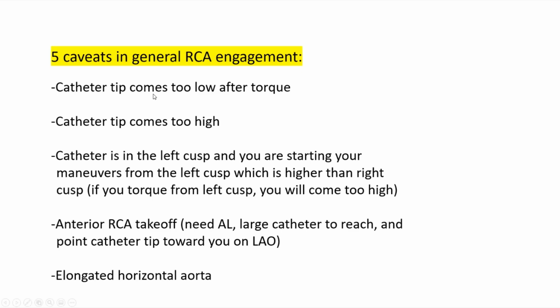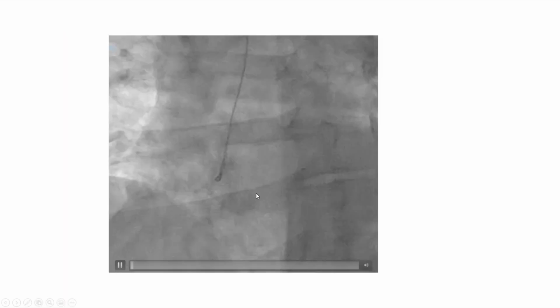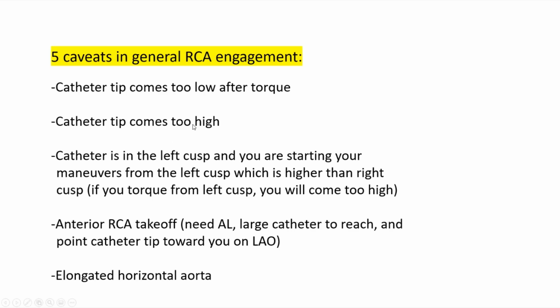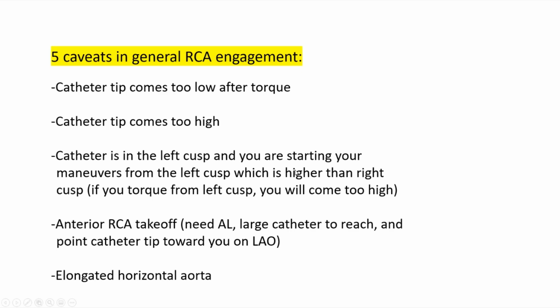As you're engaging with a JR4 or Ikari right or Ikari Left, the catheter tip can come too low after the torque. It can come too high, in which case you need to counterclock, push down and restart over. The catheter is at the beginning in the left cusp, and you are starting your maneuvers from the left cusp, which is higher than the right cusp. And if you torque from the left cusp, you'll end up coming too high. In this case, you need to push your catheter from the left cusp to the right cusp and start pulling with a clockwise torque afterward.